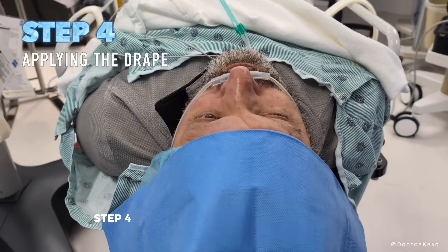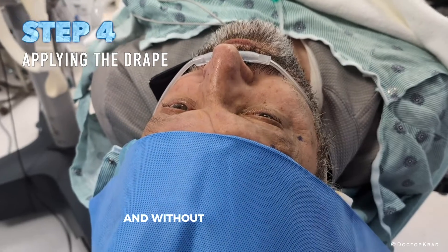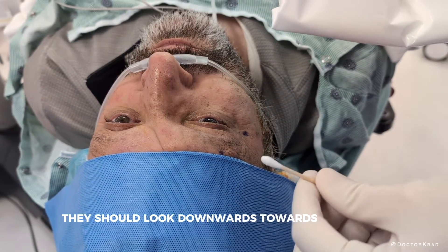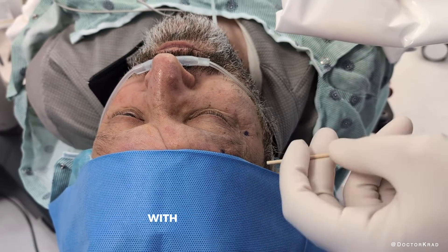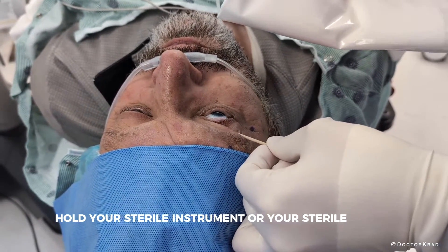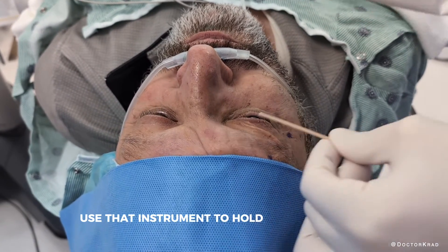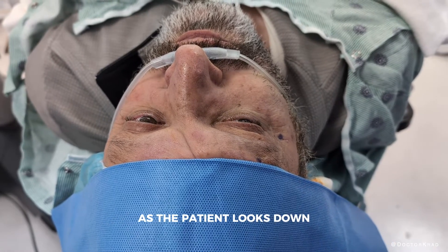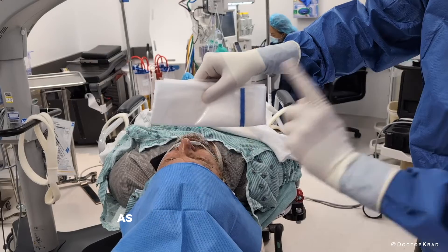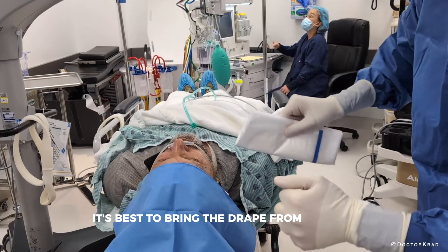Step four: ask the patient to open their eyes, both of them, and without moving their head, they should look downwards towards their toes. With the opposite hand, hold your sterile instrument or sterile object, whether it's the cotton tip or Weck-Cel. Use that instrument to hold the upper lid up as the patient looks down. Do not come down on the eye from above, as it will make the patient flinch. It's best to bring the drape from the side.